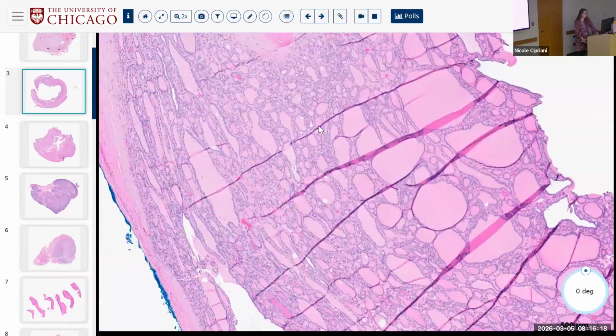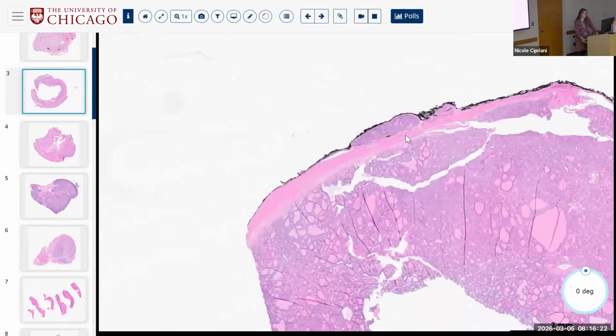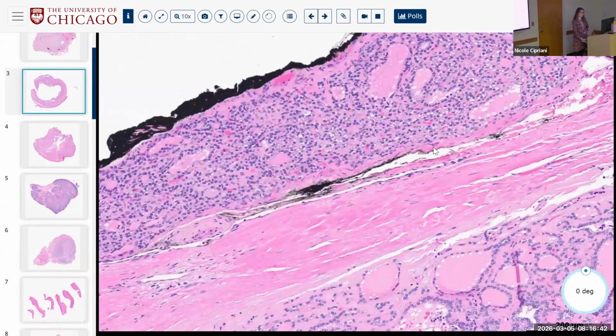So what are you gonna do, or what can you do to determine whether or not you think this focus is part of the tumor or not part of the tumor? Consider cutting deeper to see if it connects. Right, you can consider cutting deeper to see if it connects with a little sort of mushroomy stalk, which is always recommended. Let's say it doesn't. Then what?